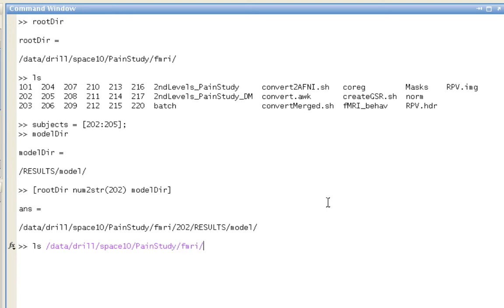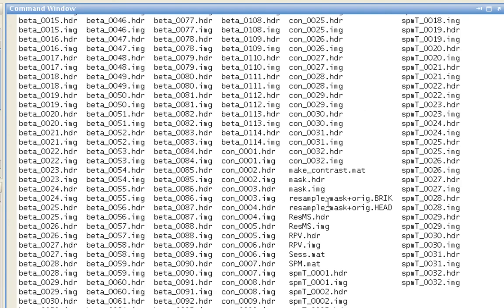Now just to show that I'm not lying to you, I type in that full path, and you see that these res.ms files are in that path.